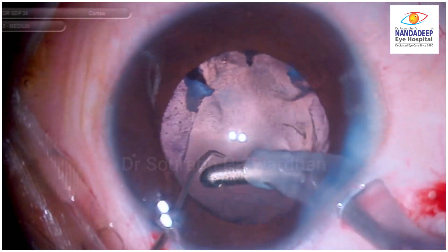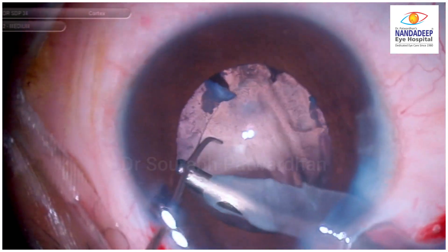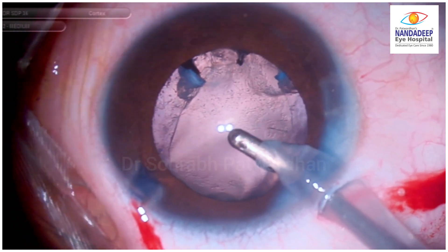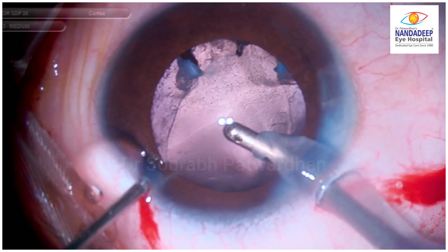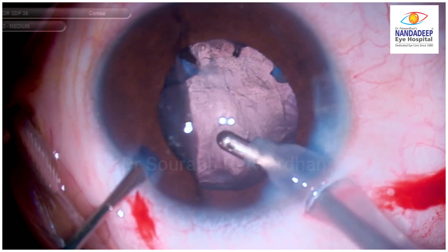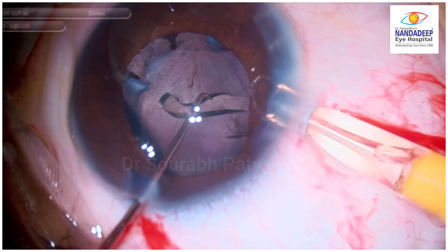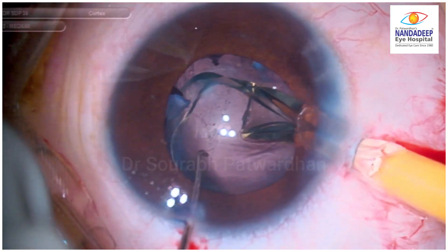A torn posterior capsule, or a tear extending from the anterior capsule to the posterior capsule, may be a problem as it may hamper placement of the PC IOL. As I complete cortex removal, the most important thing is to do the OVD-fluid exchange — that's the term to keep in mind whenever the posterior capsule or anterior capsule are compromised. This is a maneuver you should practice even in regular cases so that when the requirement comes, your left hand is already trained for it.